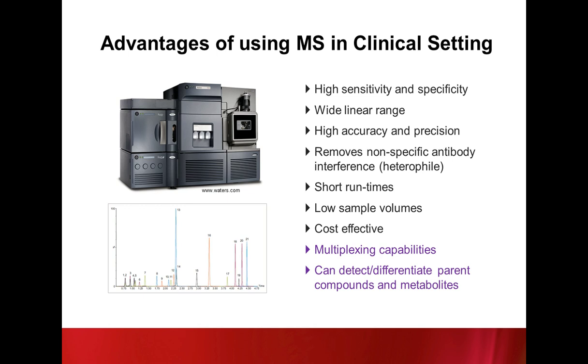Mass spec can be a cost-effective solution for drug testing, but I would say that the initial outlay of capital is quite expensive, but the actual reagent thereafter is quite inexpensive.